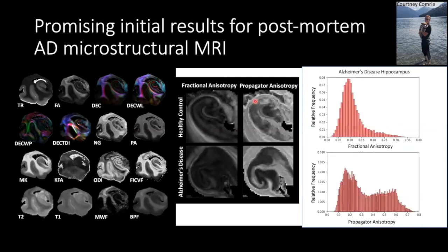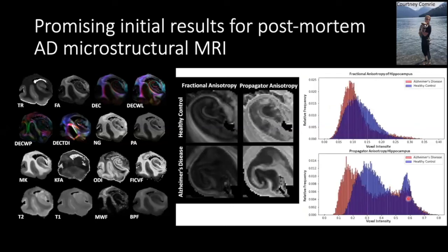And then when we look in the Alzheimer's disease, what you can see is this preferential change in one of those peaks. It's easier to see if I overlap them, where there's this reduction in this overall peak, but a different behavior overall than FA. And we're seeing this across different modalities. It's been interesting to put together, and she just finished scanning about a dozen samples. So that's where we are with that type of perspective on translational studies.